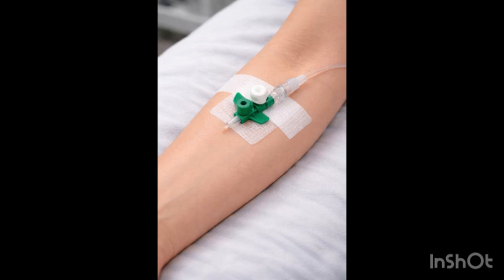And also, if you use the most distal vein and you fail the cannulation, you can still try with a more proximal one. If you try initially with the proximal one, you can distort the anatomy, and it will be more difficult to place a cannula for that patient.